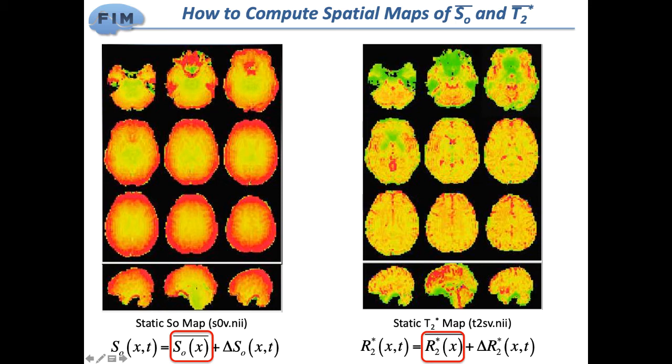And here we have a perhaps precarious, but still useful, as we will see, map of estimates of R2 star across every single voxel. And this we will use later. We can start to see that in these areas where we had issues, the estimate seems much lower. And we can also see that the distribution of R2 star is not homogeneous across the brain.